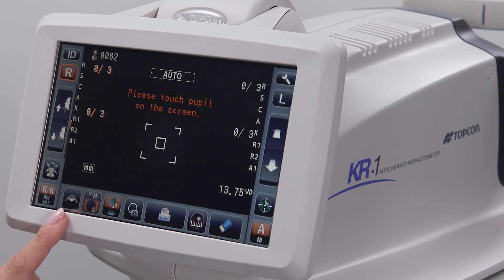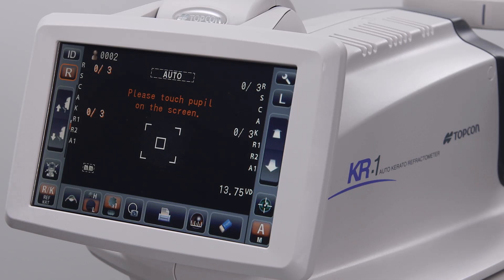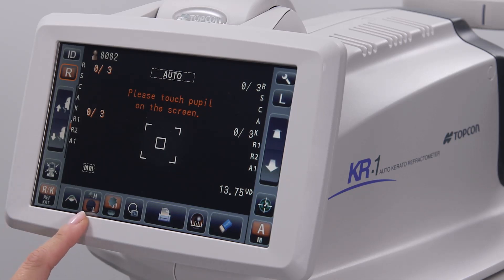The cataract mode icon can be used to increase the likelihood of acquiring refraction data through a cataract or through other media opacities. The fixation target illumination icon can be used to adjust the brightness of the image that the patient focuses on during the testing.